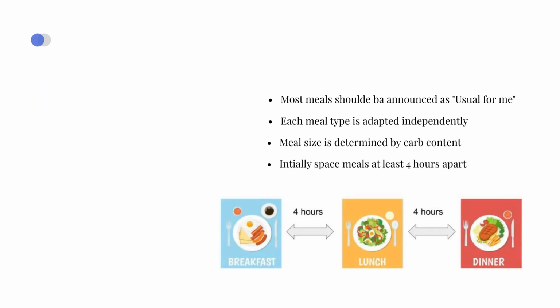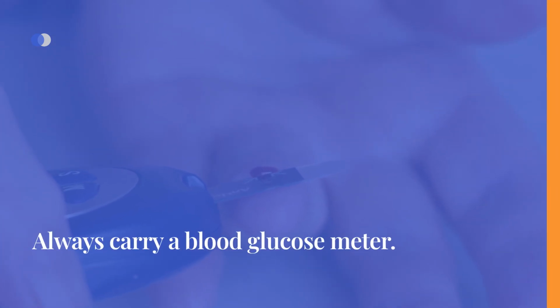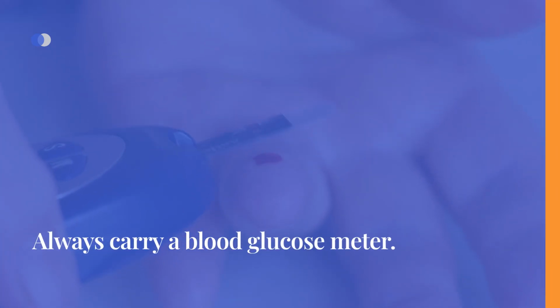In the initial week of using the iLet, spacing meals at least 4 hours apart aids the system in learning meal doses effectively. Always carry a blood glucose meter to manually enter fingerstick values if the sensor fails unexpectedly. Ensure spare sensors are readily available, as failure to replace a sensor within 2 to 3 days results in insulin delivery cessation. Users should have a backup plan in such instances.